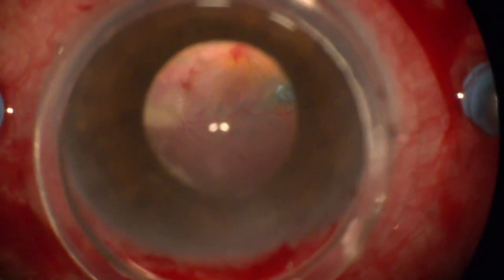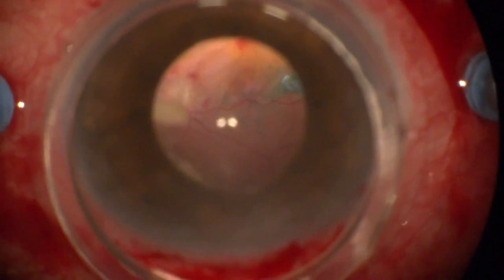And see, I'm thrilled with the image. I hope it's better than that. Okay, so just like in the other cases, she's going to put a little green in there. Hang on, Jenny, you've got an oil bubble or an air bubble. There you go. Gently. Gentle Jenny, that's what we call her. And we're going to take out the green and fragments that we've already peeled and see what we've got left that we can do. But we've taken off a significant amount of traction and scar tissue already off this macula.